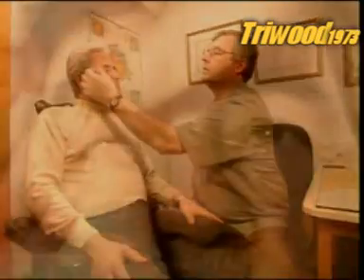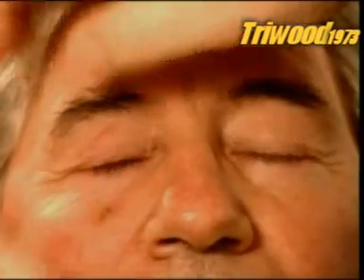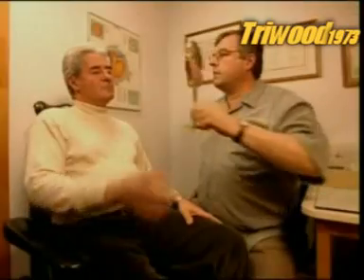This artificial eye, or ocular prosthesis, is ready. The final step is to ensure that the fit is perfect. The patient's ocular muscles attach to the implant, enabling his artificial eye to move in unison with his real eye.